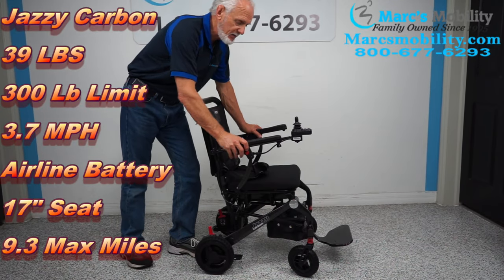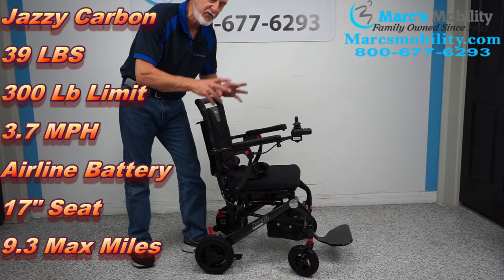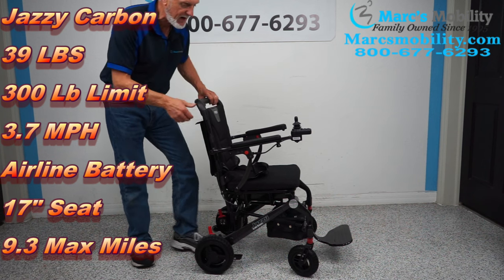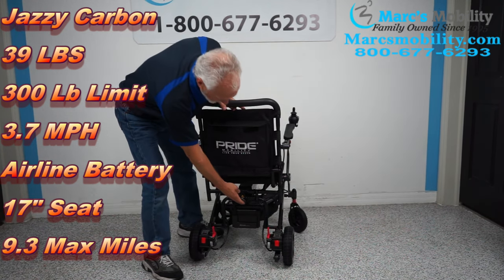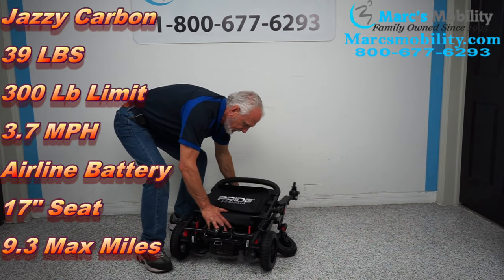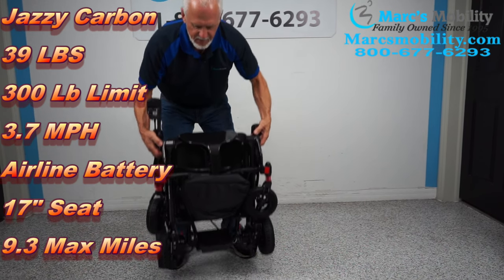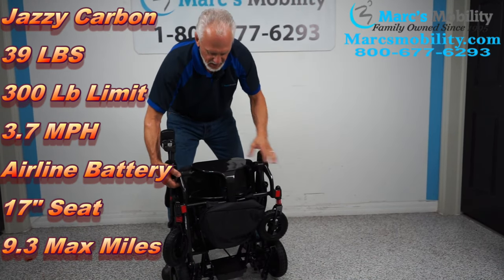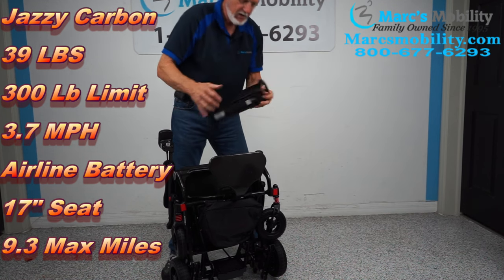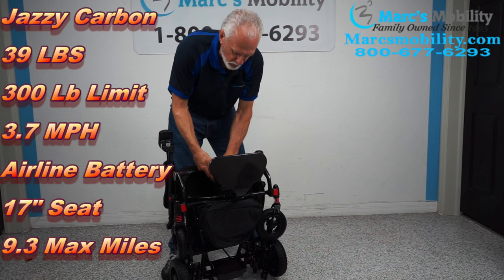The Jazzy Carbon ultralight power chair weighs only 43.6 pounds, or 39.6 pounds if you remove the battery pack. To fold the chair, all you have to do is pull this lever right here and fold it down. Pulling the battery pack out brings it to 39.6 pounds. This chair has a 300-pound weight capability.